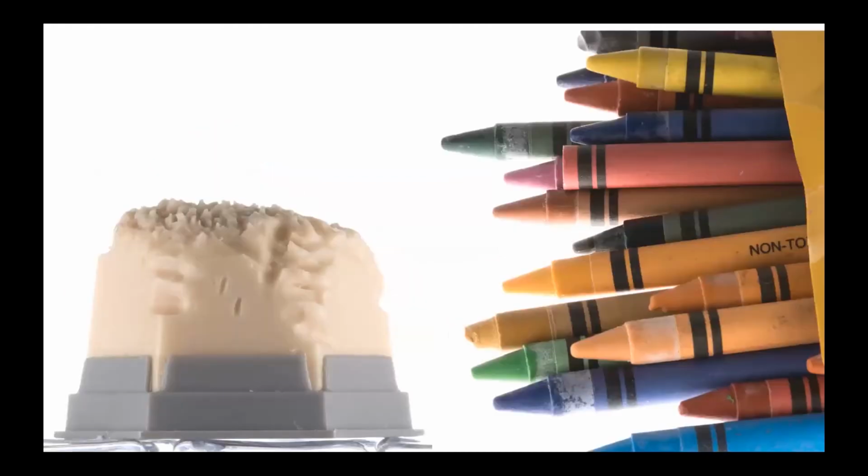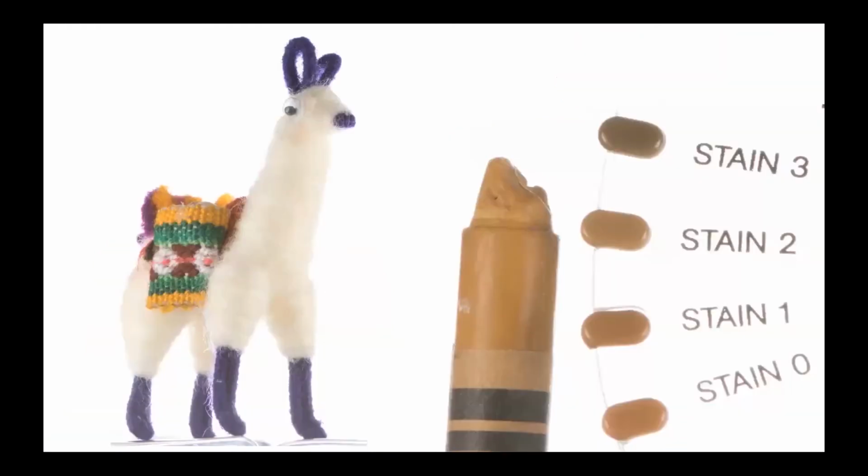But my favorite way to individualize my dies to mimic the shade of the prepared patient's teeth is the dentin wax. And this dentin wax can be modified with crayons. This is a very cheap and very effective way. A very, very good technician from Peru, Edwin Zanabria, told me about this system, and this is his present for me, this beautiful and nice llama. Please have a look.